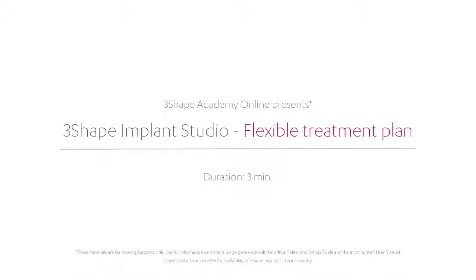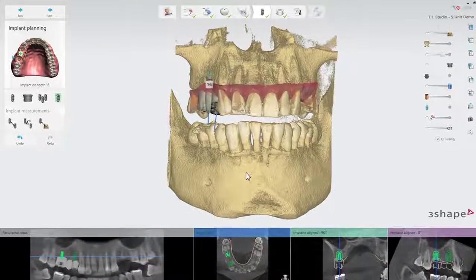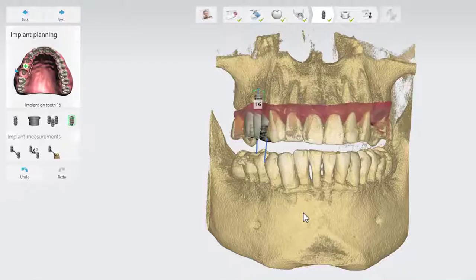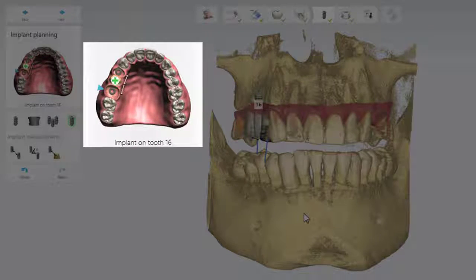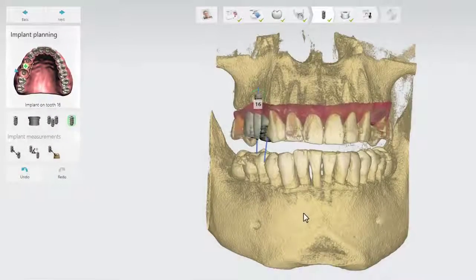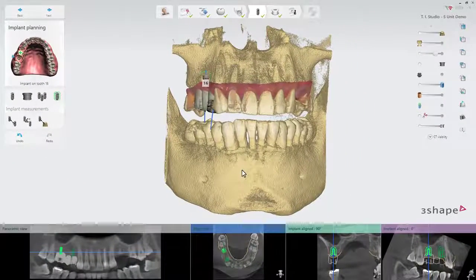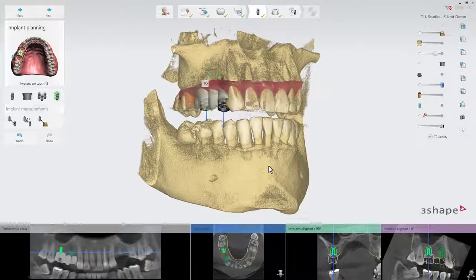In this video you will learn how to create a case with a flexible treatment plan in 3Shape Implant Studio. Sometimes during the planning step of an implant case, the initially proposed treatment — for instance, a bridge of three units on three implants — will have to be changed to a three-unit bridge on two implants, due to many factors that may influence the surgery outcome or even the decision whether to conduct the surgery or not. A flexible treatment plan in 3Shape Implant Studio gives you the possibility to easily adjust the number of implants needed.